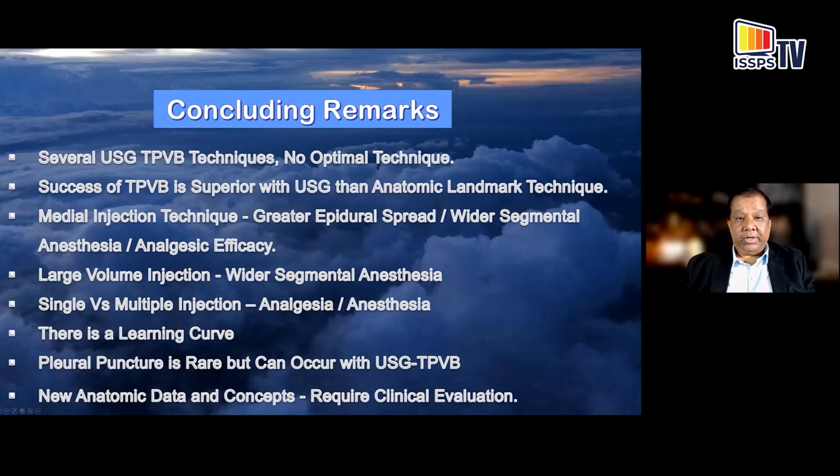Yes, pleural puncture is a touted complication, I may say so. And sometimes it is used by scaremongers to scare you away from a paravertebral block. But the incidence in experienced hands is extremely rare, including ours. So I think just because it can cause pleural puncture, it should not dissuade you from performing paravertebral blocks. If you perform it the correct way and with ultrasound guidance, I think the incidence is zero, as we have documented.